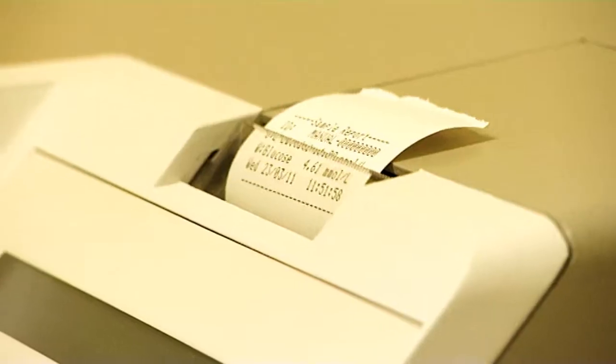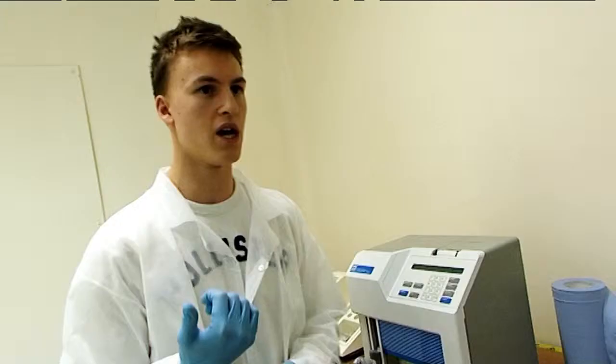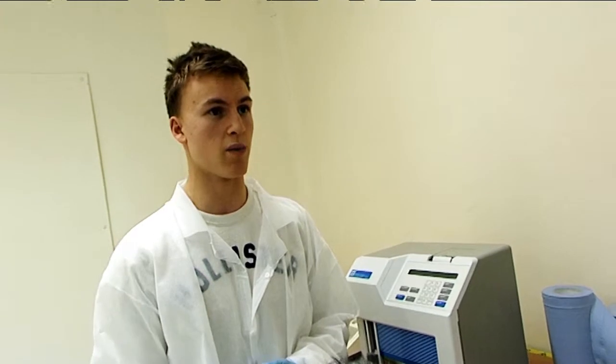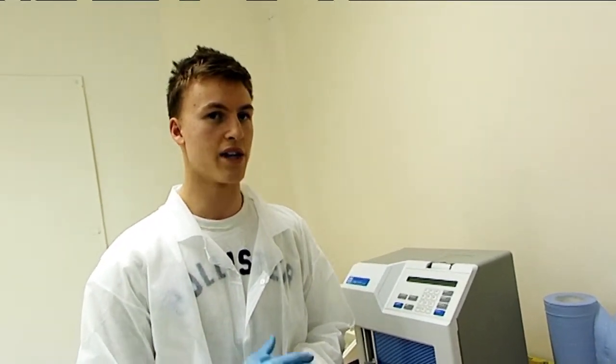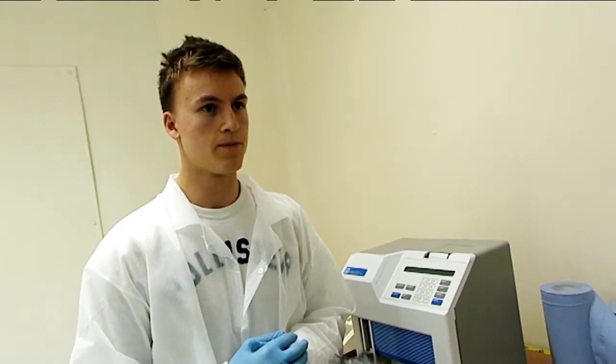This will give results related to lactate concentrations and glucose blood concentrations, but for the purpose of this study we're only going to be considering the blood glucose concentrations, and this should change according to what tests we've been experimenting with. Half the students have consumed a high glycemic index food and half have consumed a low glycemic index food, and what the students are looking to do is plot the response of blood glucose as a curve over an hour and a half as a period of time.